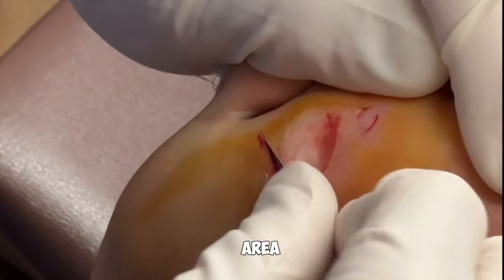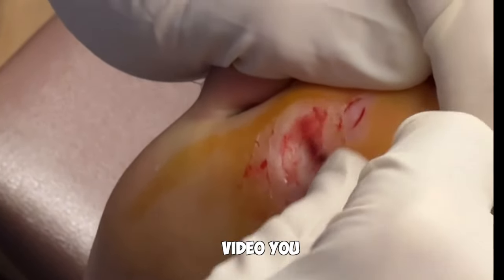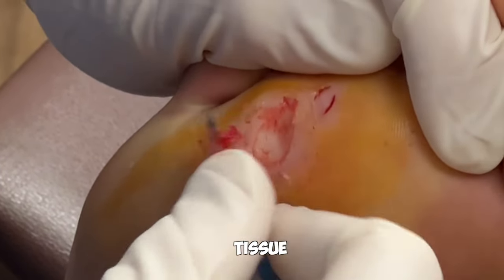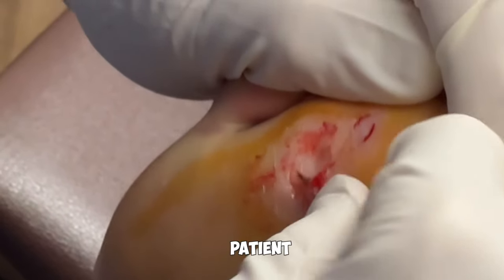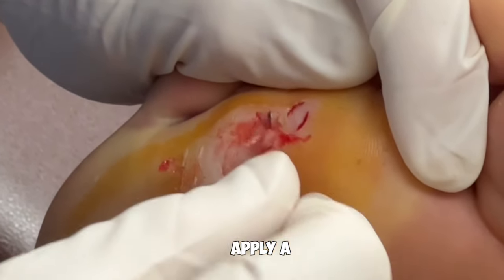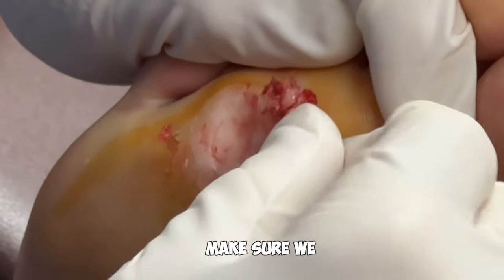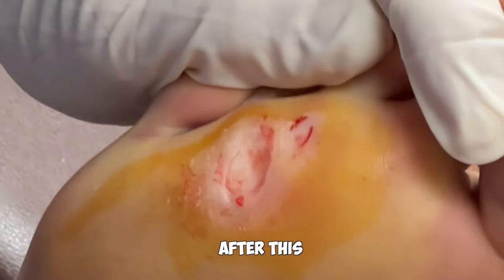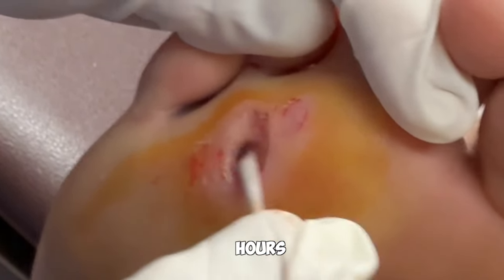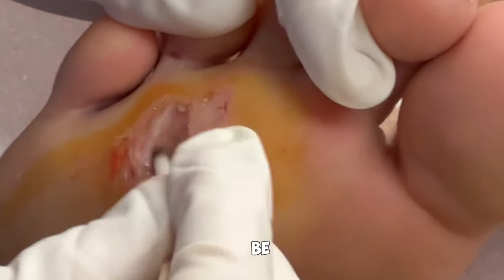I typically resort to numbing the area and surgically excising them, as you can see we've done here. In this video you can see we've gotten all the way down to the dermal tissue, just above the subcutaneous tissue. The patient tolerated this well in the office. When we're done, we apply a topical acid called phenol — that's just a little bit of an insurance policy to make sure we got all those viral particles. After this is all done, the patient will get a gauze bandage, keep that on for about 48 hours, then it's just Neosporin and a band-aid. Usually within two to four weeks, this will be completely healed up.